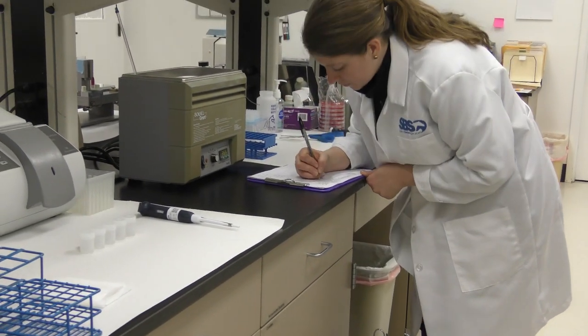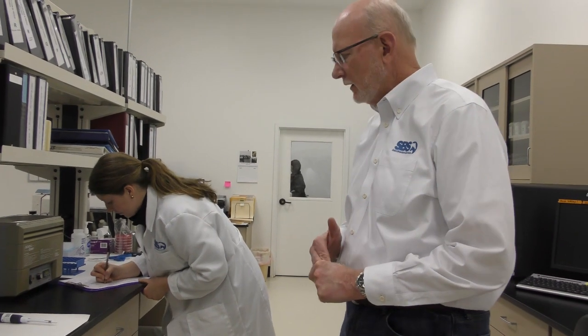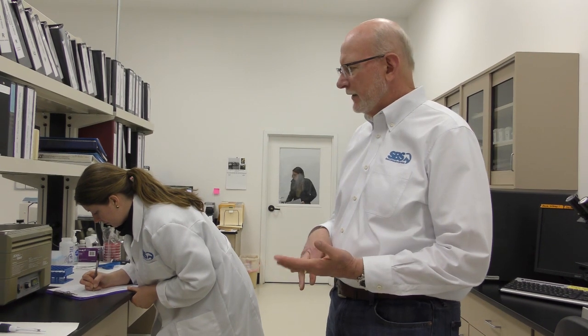Our routine analysis of post-thaw quality for all frozen semen that's frozen here, and any imported semen that we evaluate, goes through the same process. What's important here is that it is done objectively. It is done blind by the person who's reading the motility on the CASA system. We do a post-thaw culture. We do a 30-minute post-thaw incubation, and we do a count on every sample.